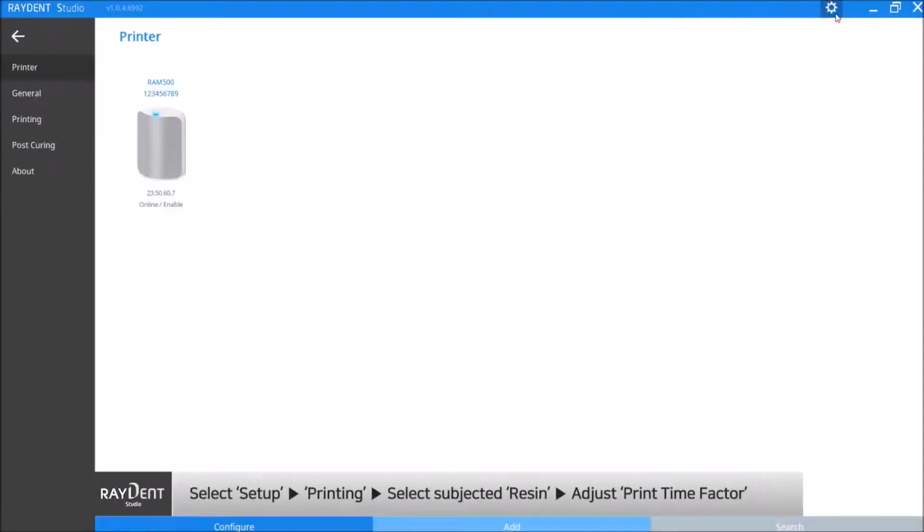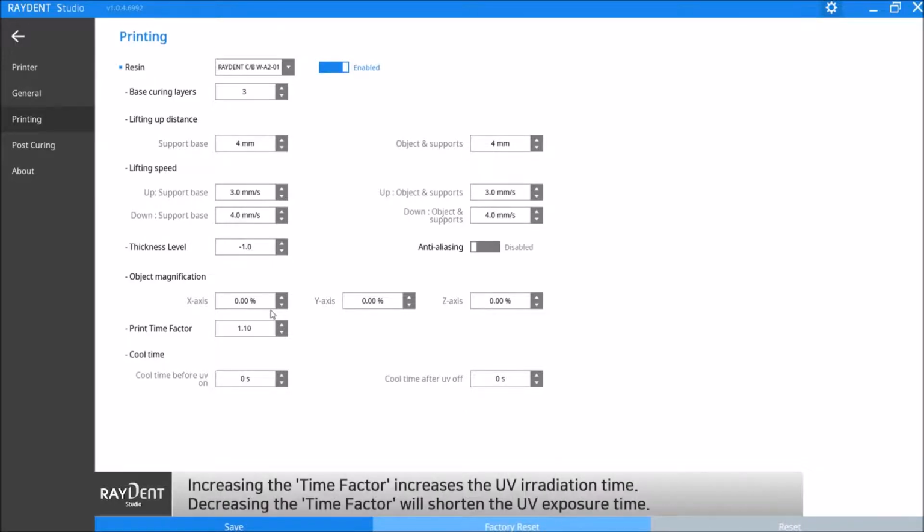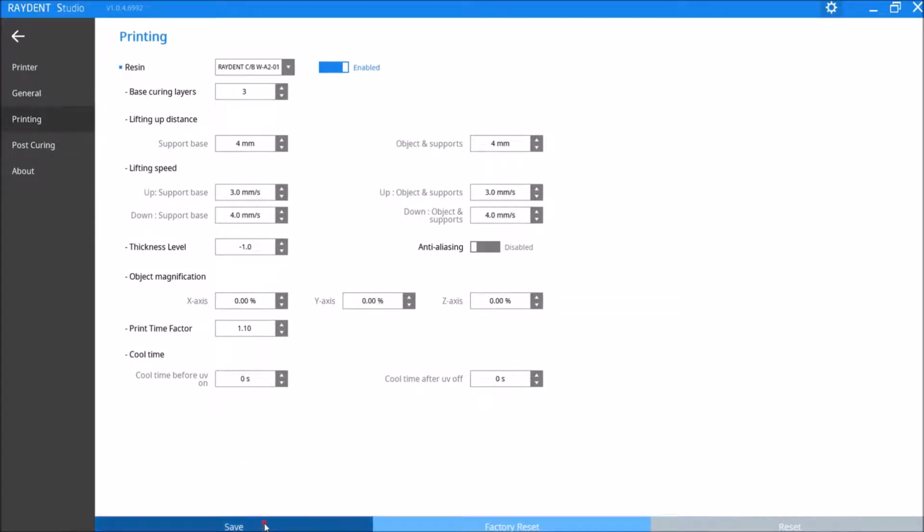Click Setup in the upper right corner, select Printing in the left menu, select the resin you're using from the list, and add 0.2 to the time factor value and save at the bottom. Time factor is the multiplying irradiation time rate when the light is scattered. Raising the time factor will increase the duration of the light cure, and decreasing will decrease the duration of the light cure. More light cure time means better adhesiveness between slices.